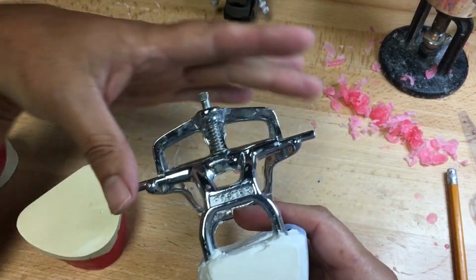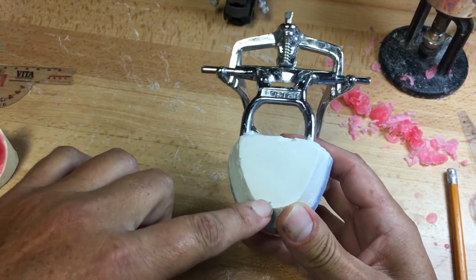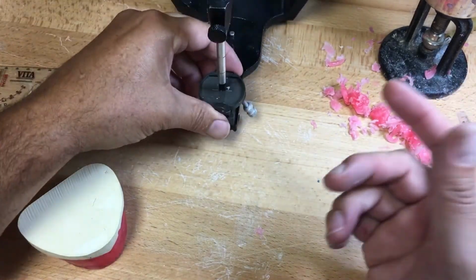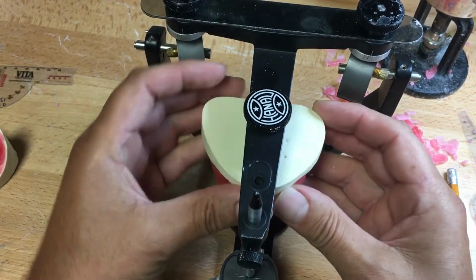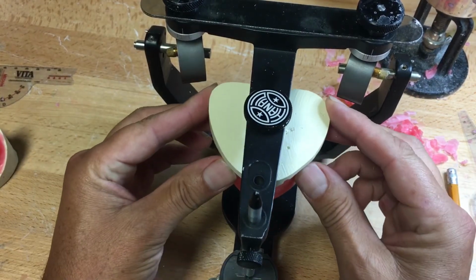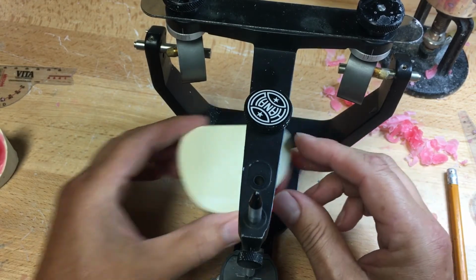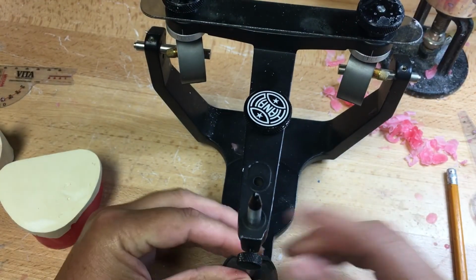Again, we can look at our plane line articulators. These are 110, and average value 110 is the midline of the centrals. So Carrie has developed that puck that you poured up so you could make your jig to mount your maxillary occlusion rim exactly in Bonwell's triangle with the Bonwell angle in relation to the condyles, so we can have an average group function.